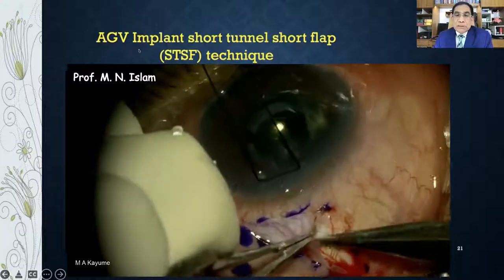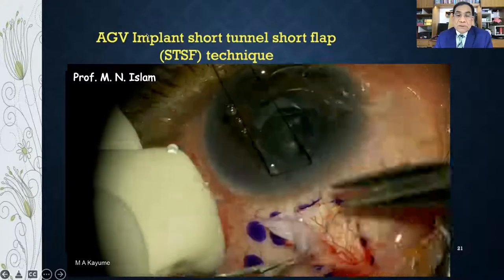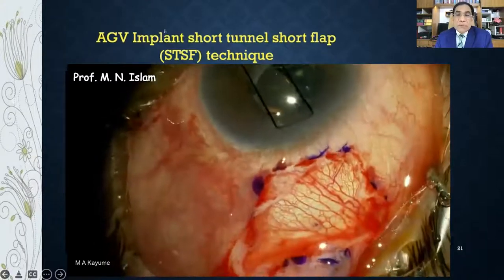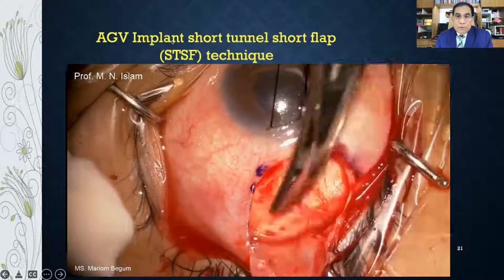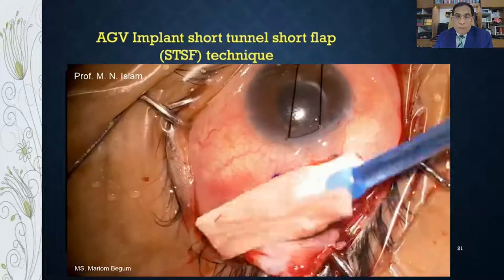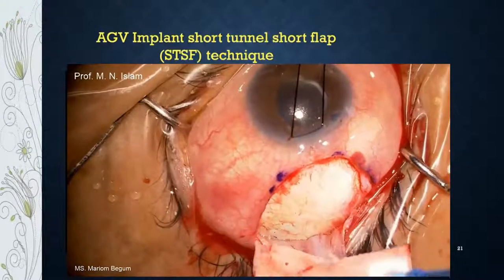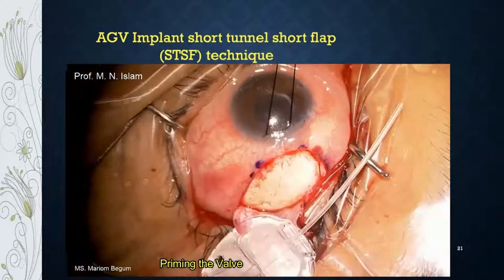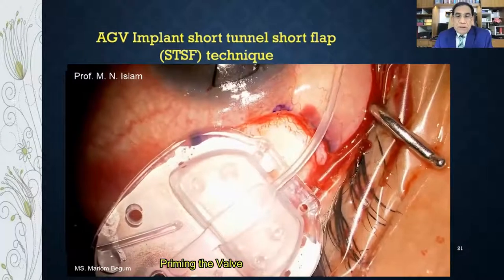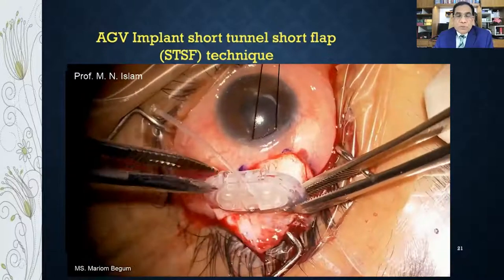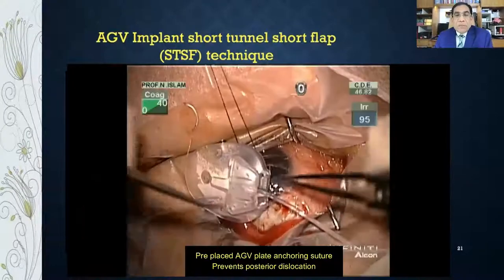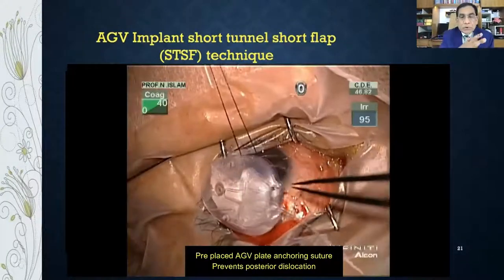You can separately dissect the conjunctiva and Tenon's capsule for a very clean dissection. After dissection, open the supratemporal quadrant. An important step is priming of the valve — inject BSS through the tube so the valve opens. There are two elastic membranes in the valve that may be adherent and must be primed.